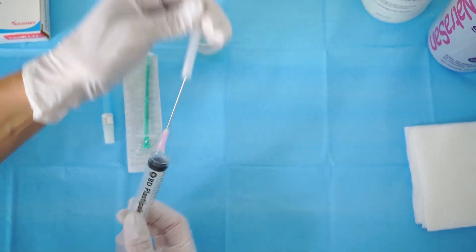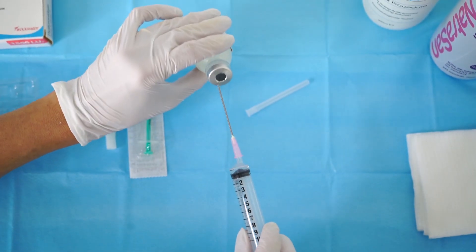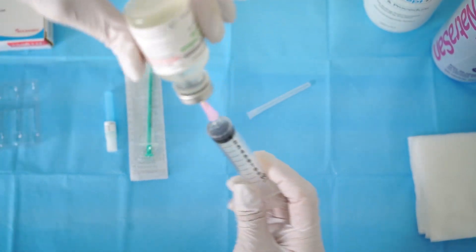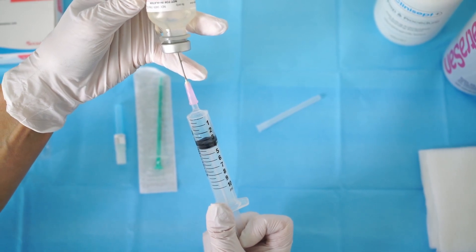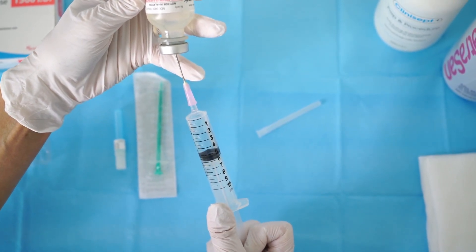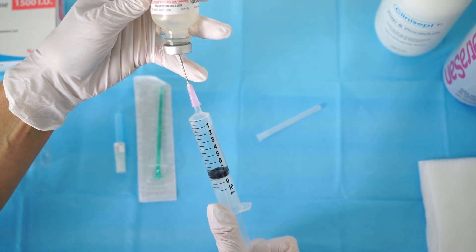Okay, first of all, as I said, we've got our syringe with a needle, 10 ml, and we're going to get 10 ml in. Just slowly.